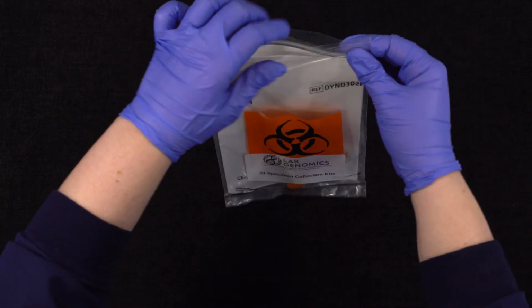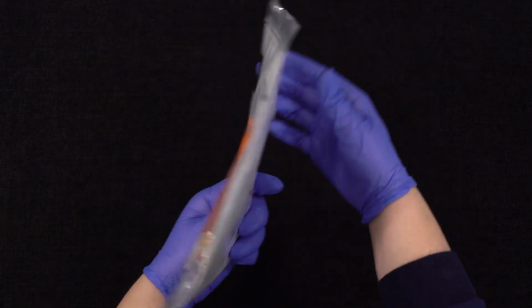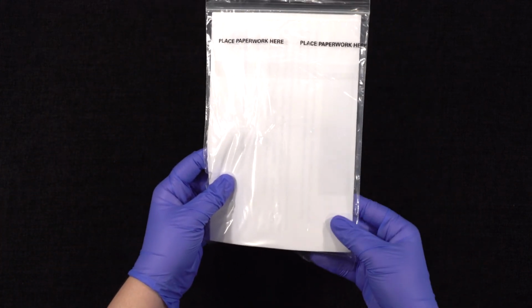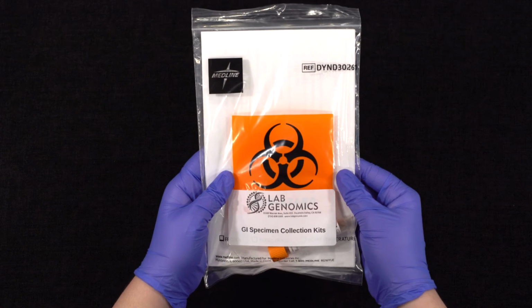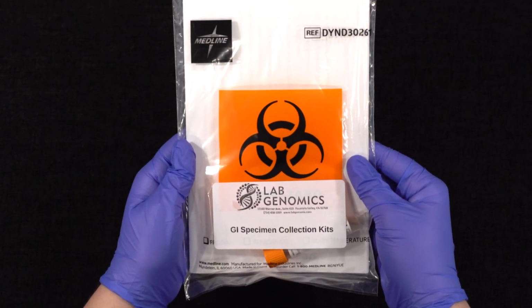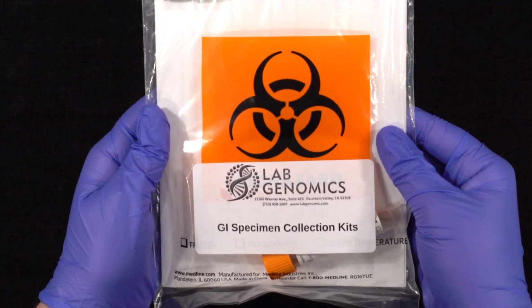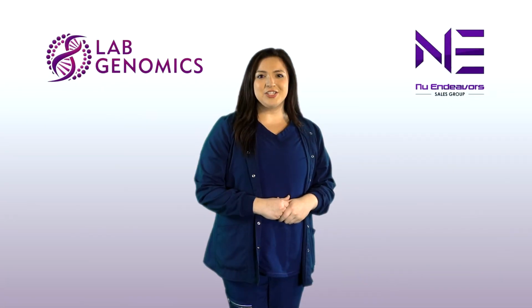Before placing the sample tube in the biohazard bag, please make sure that all the appropriate information for the patient is placed on the tube. This includes the patient name and date of birth. Check again to make sure all paperwork is complete and placed in the outer pouch of the biohazard bag before submitting to Lab Genomics.